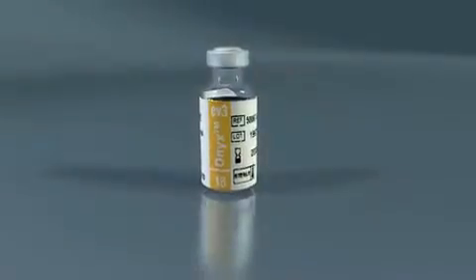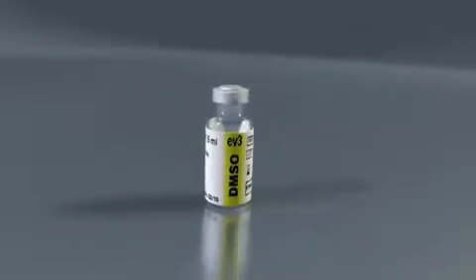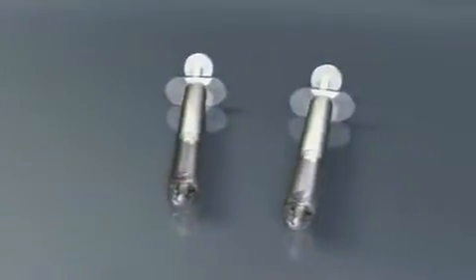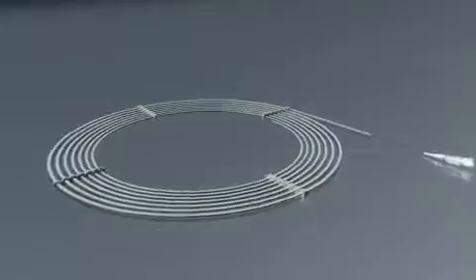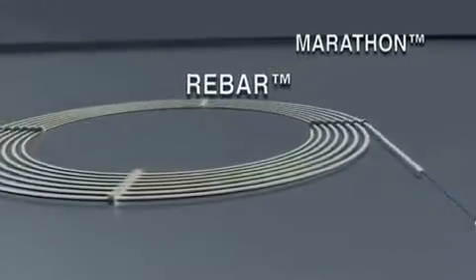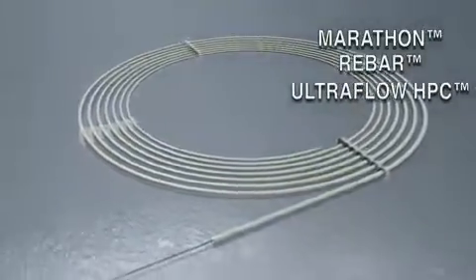The Onyx Liquid Embolic System consists of a 1.5 mL vial of Onyx, a 1.5 mL vial of DMSO, one yellow 1 mL DMSO syringe, and two white 1 mL Onyx delivery syringes. A DMSO-compatible delivery microcatheter indicated for use in the neurovasculature — for example, the Marathon, Rebar, or Ultraflow HPC catheters — must be used to access the embolization site.